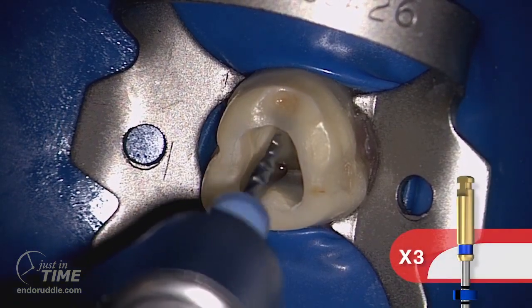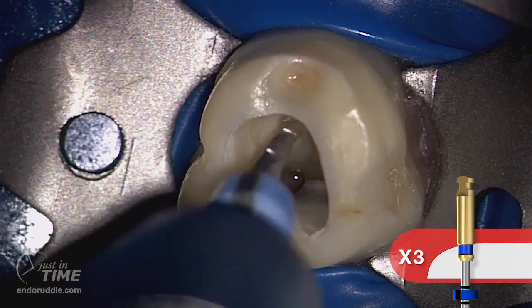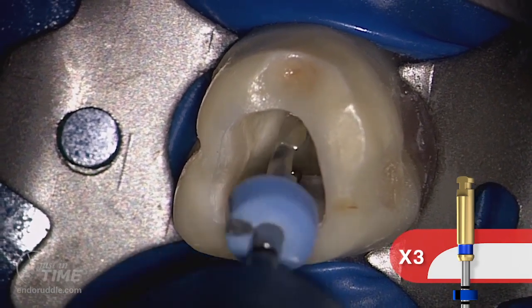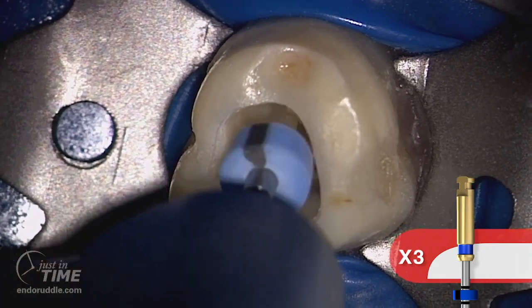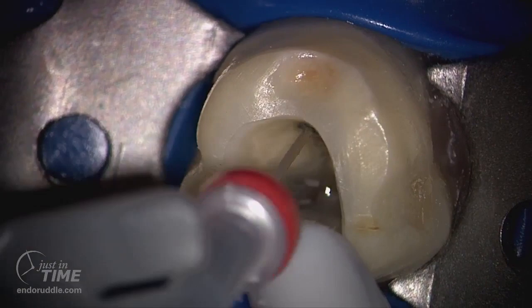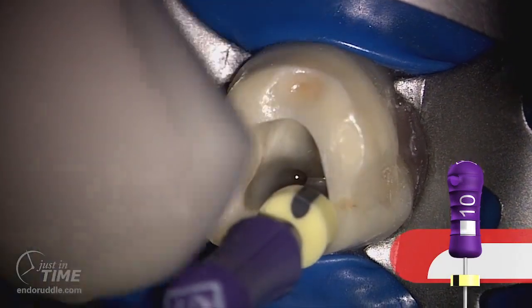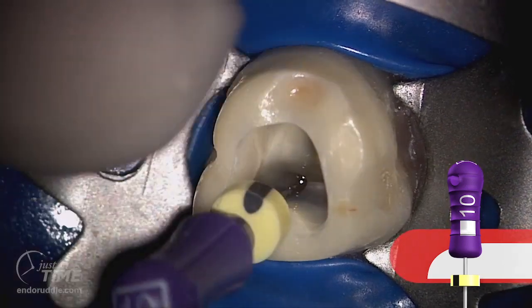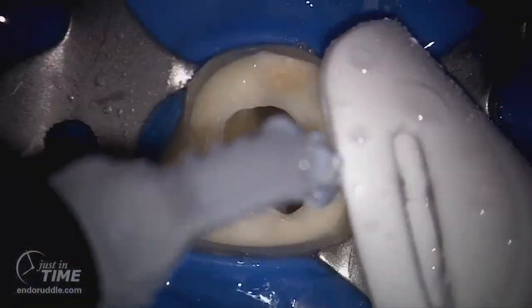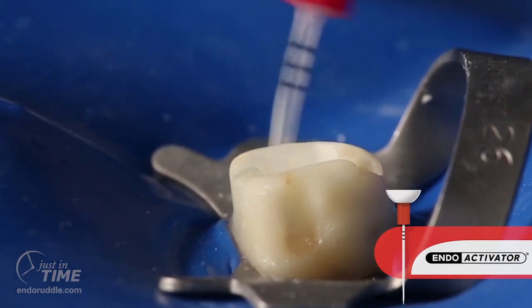In larger canals, when we desire more shape, we proceed to the X3 file. Let the X3 float in and passively run towards resistance. Upon light resistance, begin to brush on the outstroke. Recognize that brushing improves the contact between the file and dentin, but importantly, brushing allows the file to move towards length. Notice the debris over the active portion of the file. Irrigate, recapitulate, and re-irrigate. To determine if the shape is done, either inspect the flutes of the file for dentinal mud or gauge the foramen with a nickel-titanium 30-02 hand file. This finishing criteria assures we have met our shaping objectives in preparation for active irrigation.